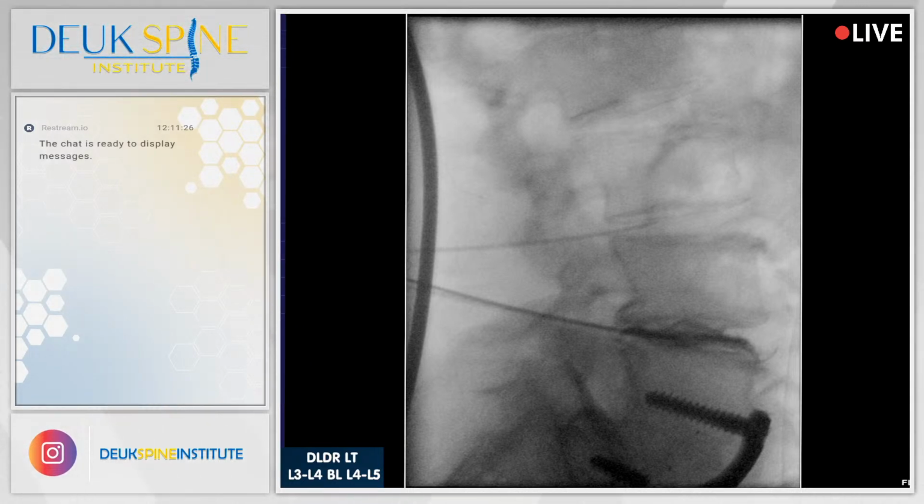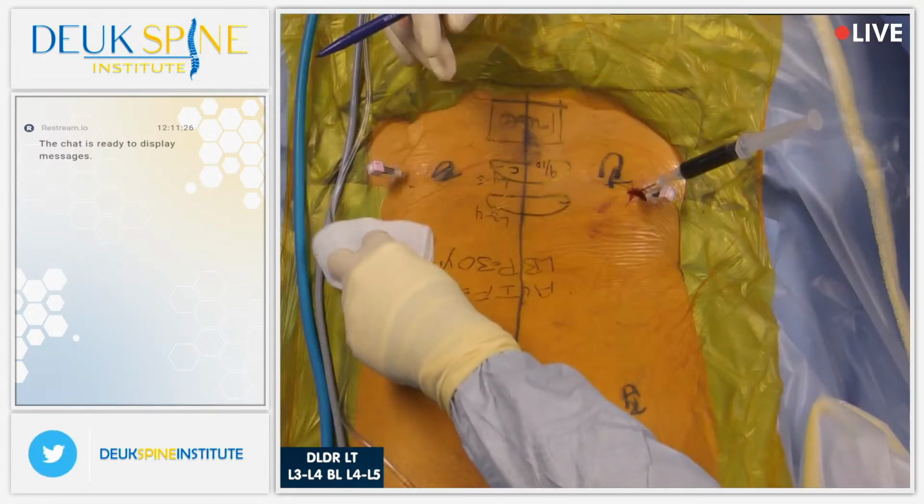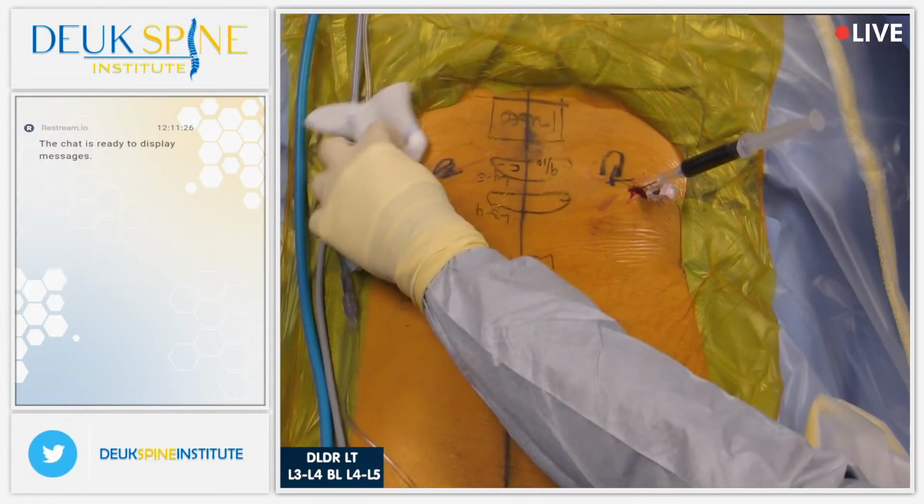You're going to get to go to sleep soon. Now notice how, guys, on this side, you see this, Arias, the dye coming out here? Yes, we see it. Because the dye went in one side into that L4-5 disc and now out the other side through the needle. It's contiguous. Yeah. Is that better? Yeah.